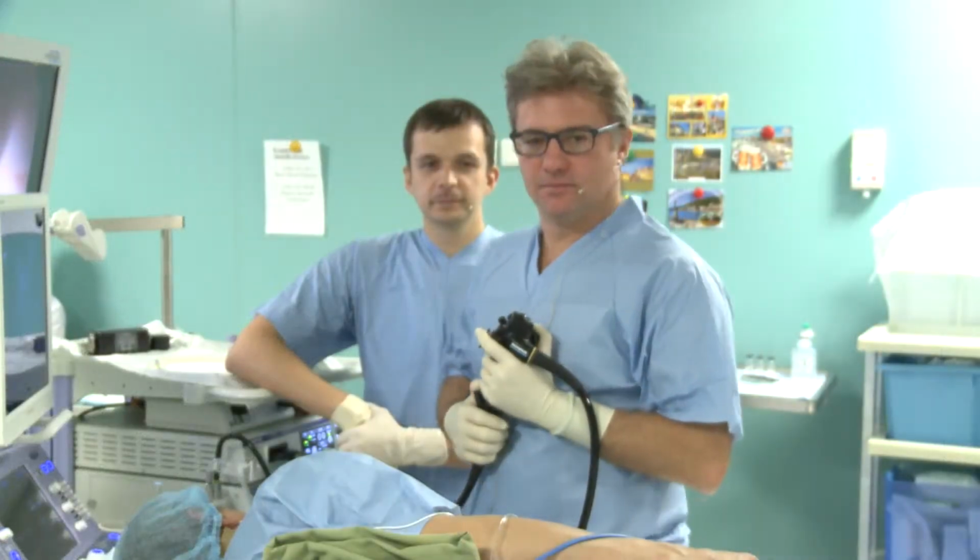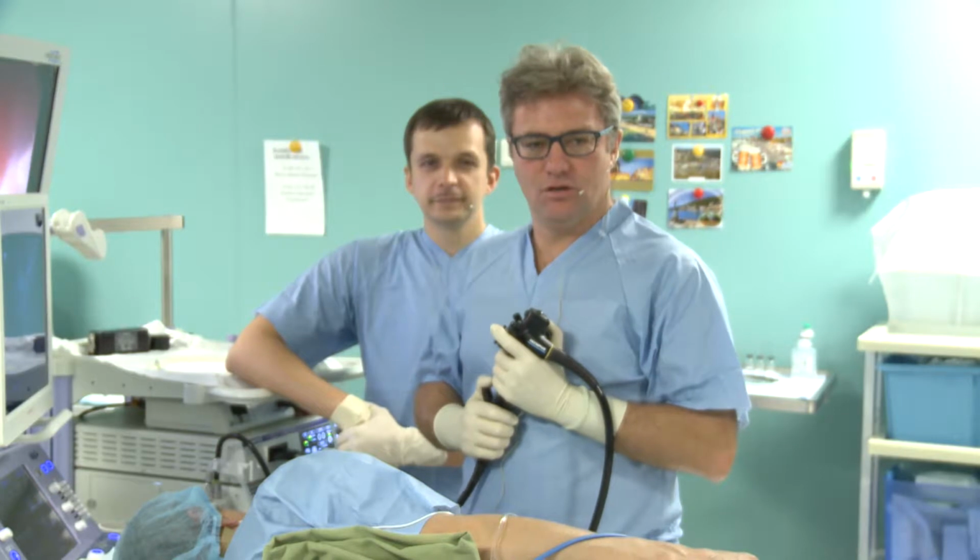So how can we resolve the situation? How can we help such patients using EUS? So let's see if our colleagues can manage successfully this really complicated task.